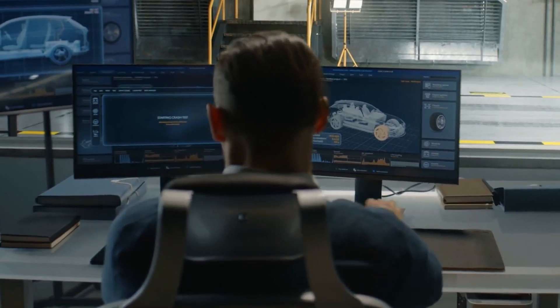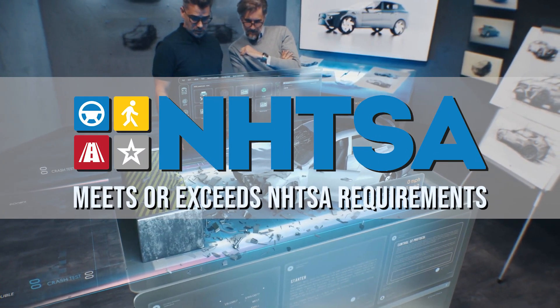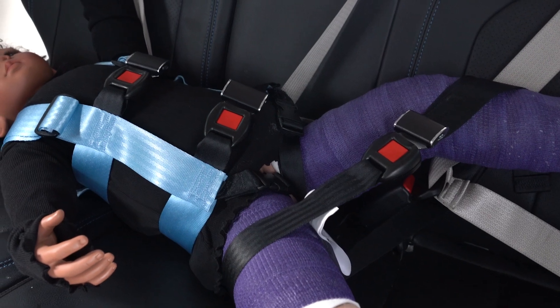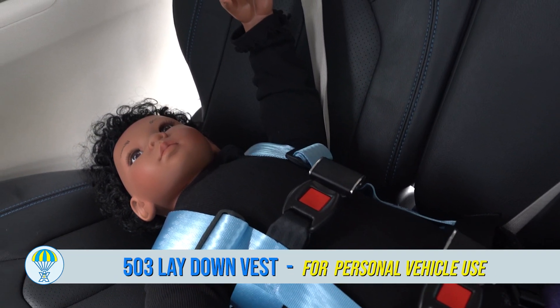Like all Easy On products, the 503 has been dynamically crash tested and meets or exceeds all NHTSA safety requirements. So you can trust that your child is safe and secure during transport. The 503 is the smart choice for safe transportation.